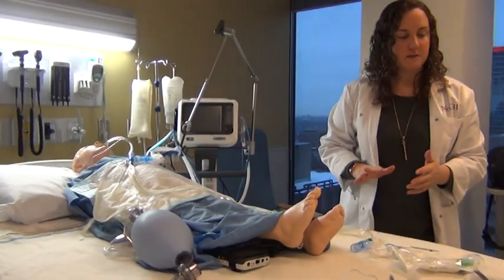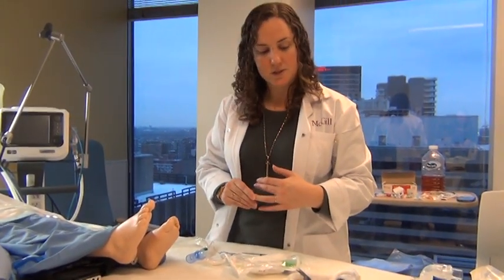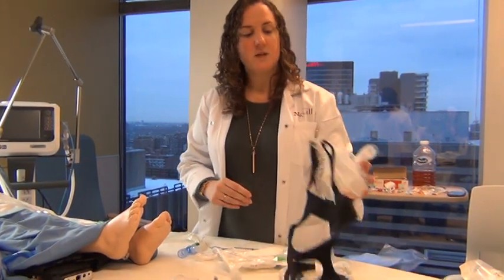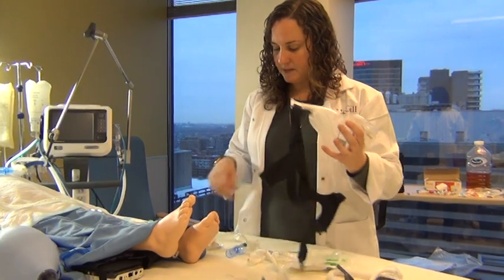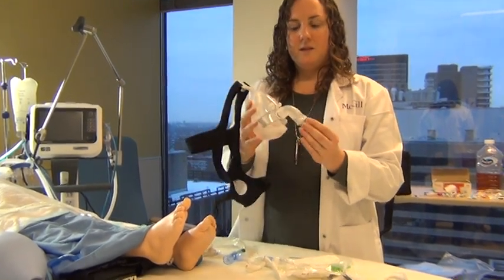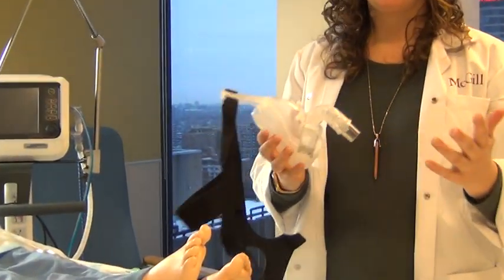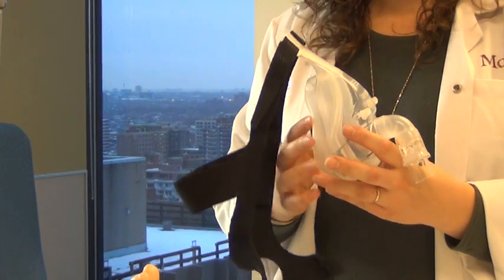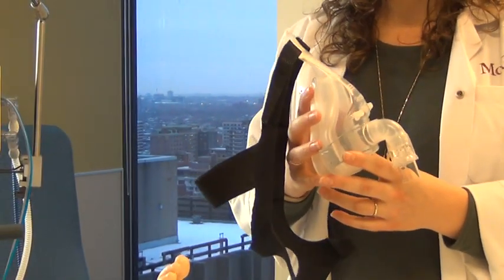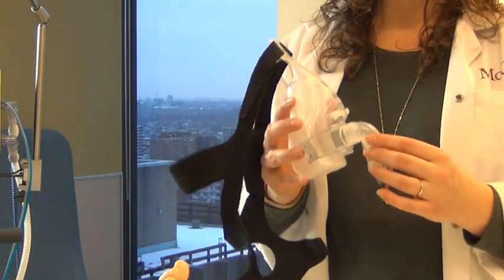So that was invasive mechanical ventilation. Now, if you want to talk about non-invasive mechanical ventilation, one of the most common ones that you will see is actually this, a BiPAP or a CPAP mask. So like we might have CPAP at home for sleep apnea, it's a little bit of the same idea, where it's continuous positive airway pressure.